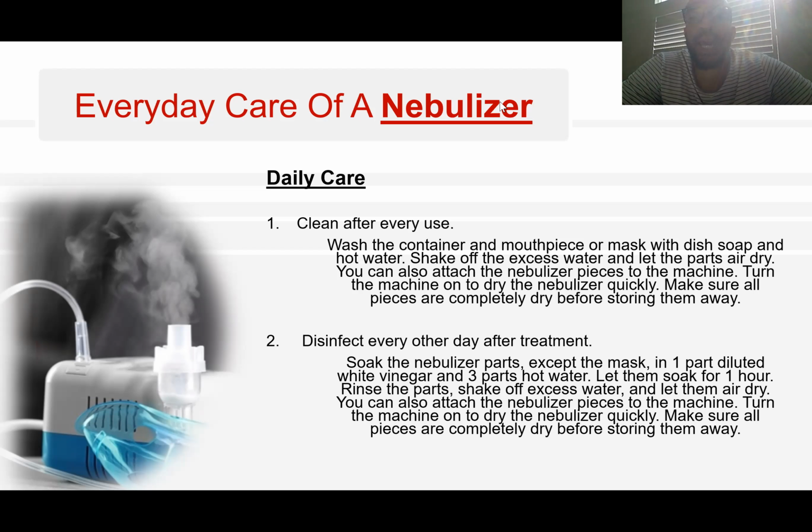Now, if the patient does have a machine, then we want to disinfect the machine and its parts every other day after treatment. So you want to soak the parts, except for the mask, in 1 part vinegar, I'm sorry, with 3 parts of hot water, and let them soak for an hour and then let them air dry. And it's as simple as that.